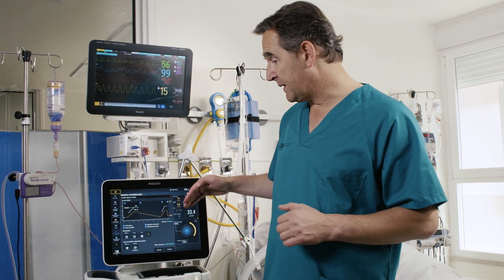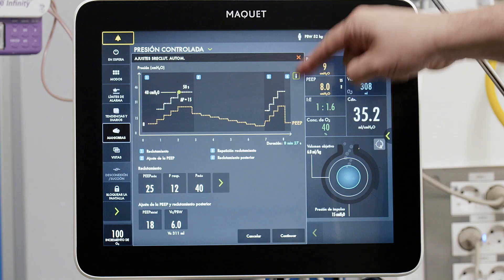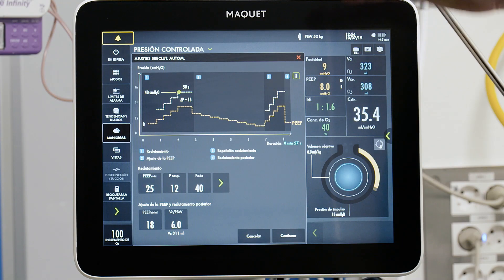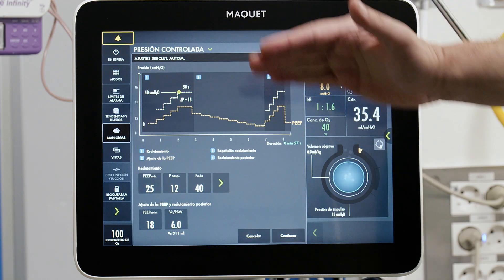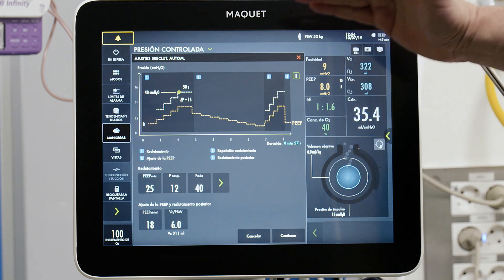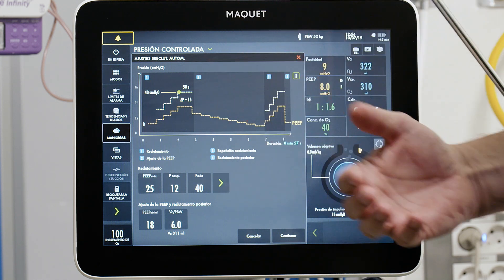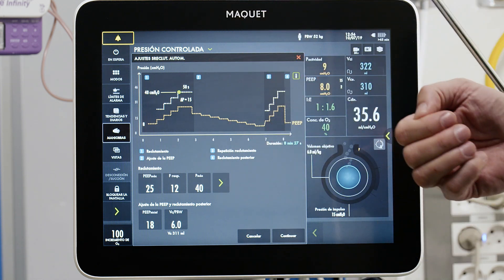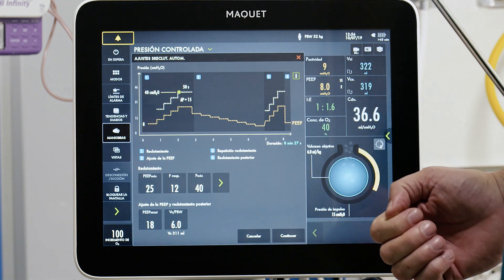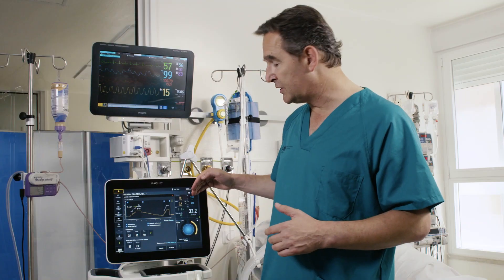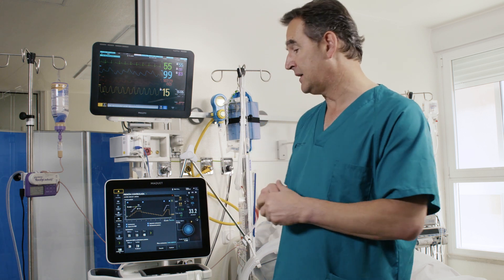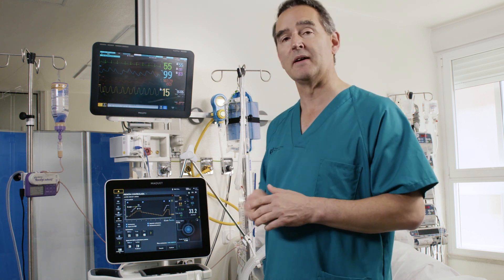With this information the system gives a recommendation for the optimum PEEP, which will be set 2 cmH2O above the closing pressure — the point of maximum compliance. The system then immediately performs a new recruitment maneuver after switching back to pressure control ventilation, identical to the first, and finally returns to the previous settings but with the newly identified optimal PEEP level.